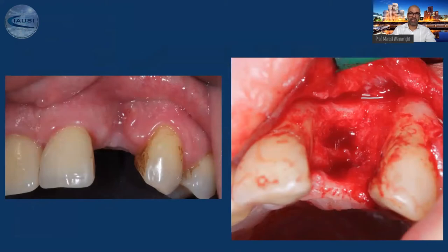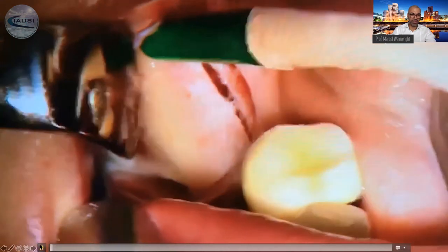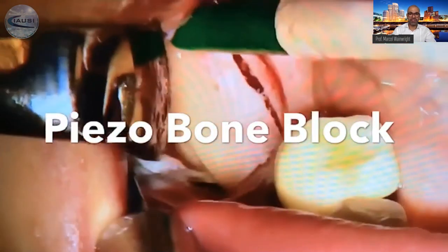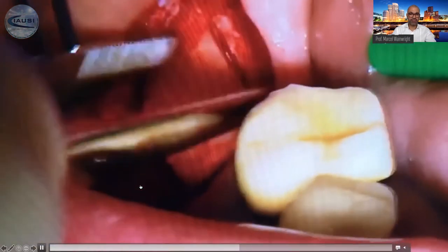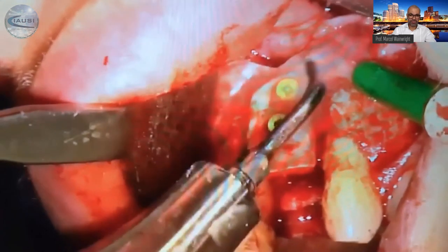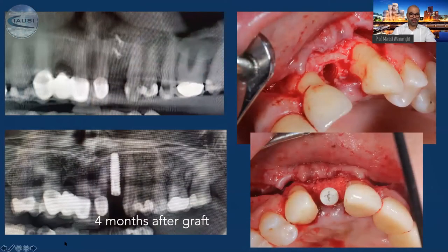Here's one clinical example in a video where we harvested the bone with the piezo. It's very easy — I do just a single incision inside the bone, take out the bone block; it takes probably five minutes. Then this bone block is fixed with two screws. I get rid of the sharp edges with the tip, and here you can see that we are able to regain the bone.